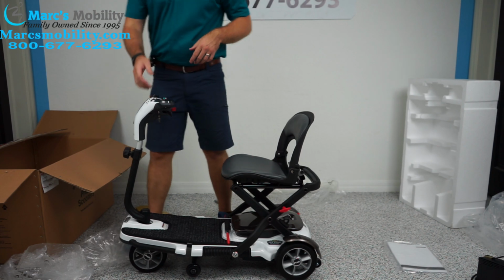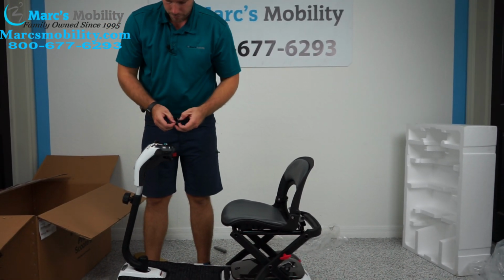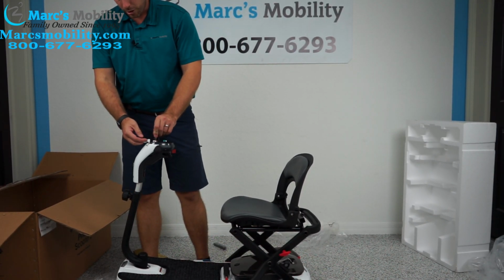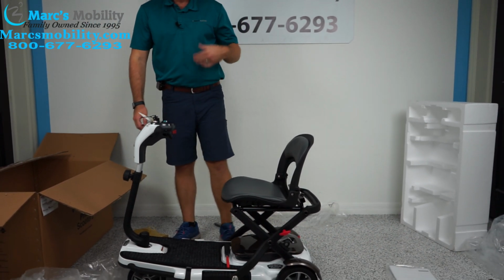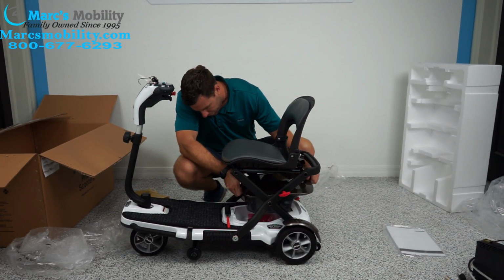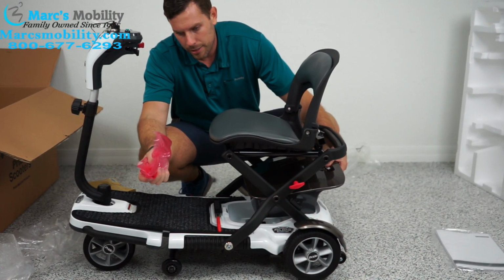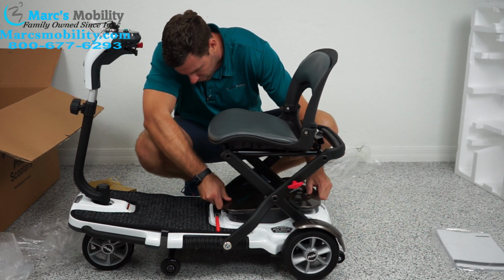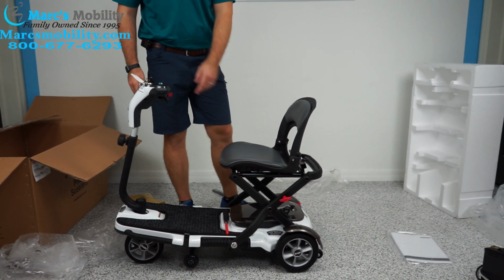So then you're going to locate your keys. Your keys are located around the handle. You can slide it off or clip it off. Remove the covering over the key switch. And now when you go to turn it on, you will see that although your battery pack's in there, nothing comes on. So what you have to do is lift your battery pack up. And underneath your battery pack, you're actually going to see they had a piece of plastic that was inhibiting the connector block on your battery casing from making a connection on the unit. So once you remove that, then you will turn your unit on and you will see that you have power.